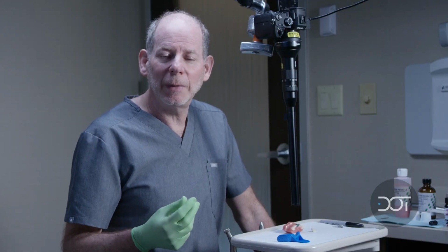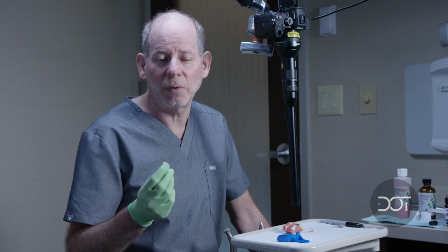Today's mini tip is the analog open tray implant impression technique. In our previous mini tip, you learned how to make the customized impression coping. Now that impression coping has been made on the perfectly sculpted tissue that you were able to create with your provisional, we want to pick up that impression coping so that we can send that to our lab. So we're going to share with you step by step how I do that today and give you some pointers to make these impressions even easier and more accurate for your lab technician.